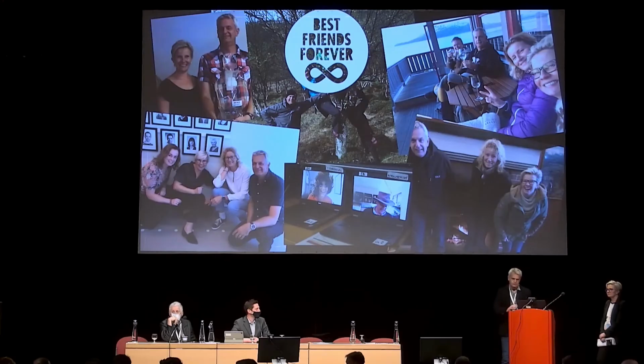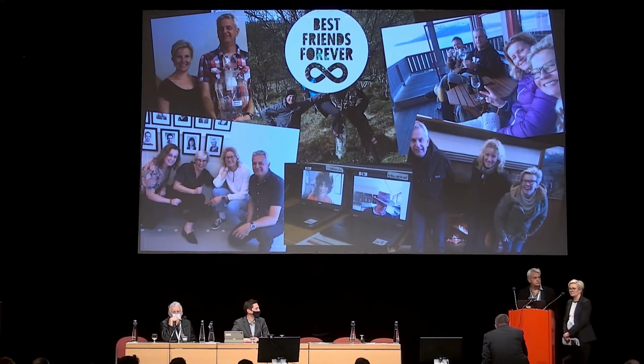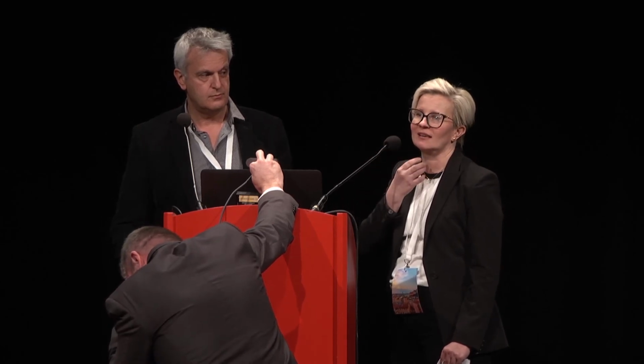Paddy, thank you. I've got a question for both of you because I can see both sides. But Tina, I'm worried that putting the scope down and anaesthetising the area, how much of the problem are you actually causing? Are you causing some of this dysfunction by instrumenting the patient and by adding drugs down there? Yeah, so we anesthetize the nose and maybe a little bit of the oropharynx, but we stop the scope behind the tongue, so it's not in the larynx, and we are not anesthetizing the larynx because we are not there with the scope.